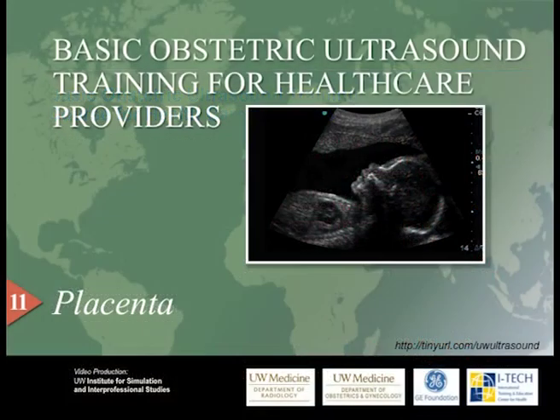My name is Dr. Christina Adams Waldorf, and I will be narrating this 11th video in our pregnancy ultrasound series. This video will focus on identifying the normal and abnormal placenta. Please visit our website for access to all of our video and training materials.